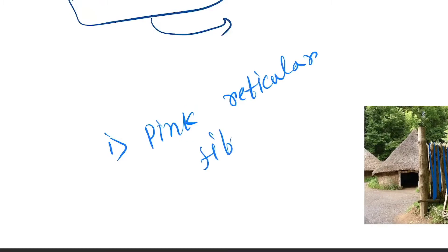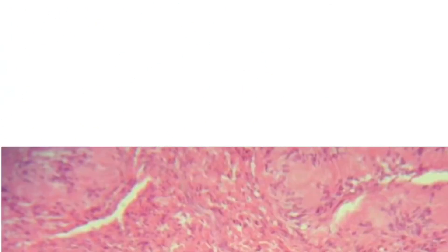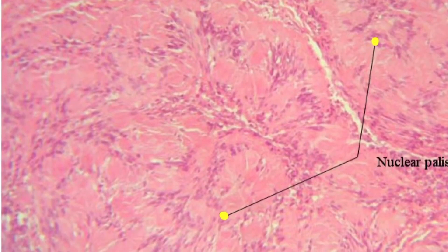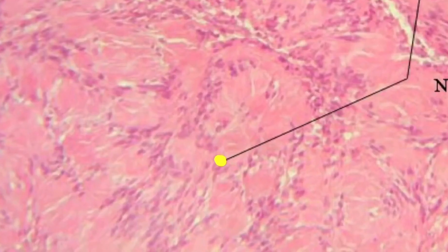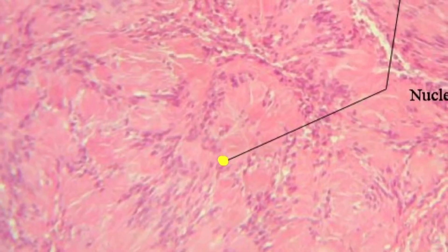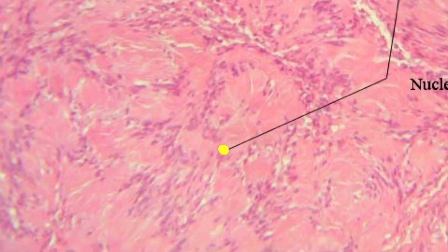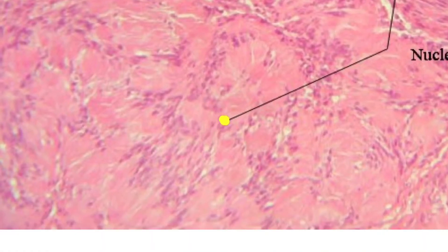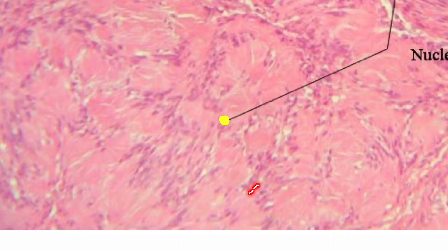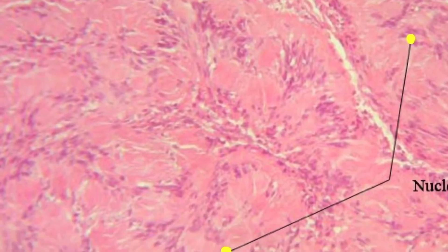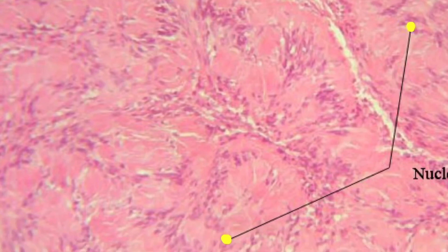Now let's see the histopathological slide. Here you can see those are the rod-shaped nucleus, or spindle-shaped. Here you can see a complete palisade-like structure. This is the palisade-like structure. Next, here you can also see palisade-like structure is formed.